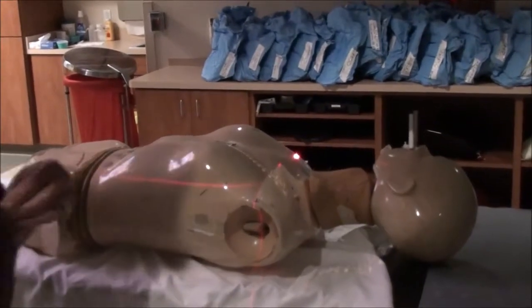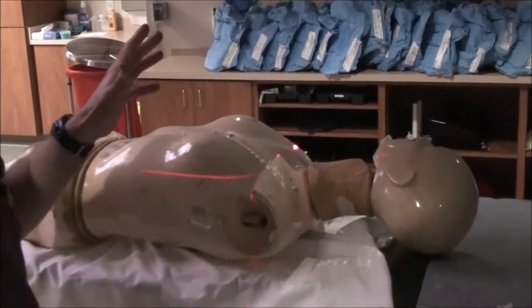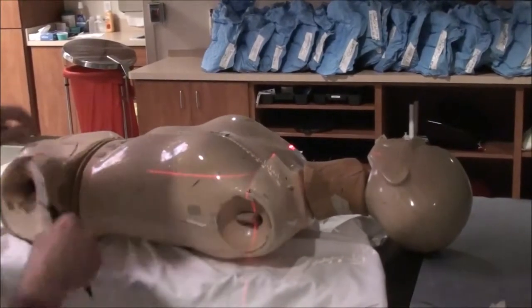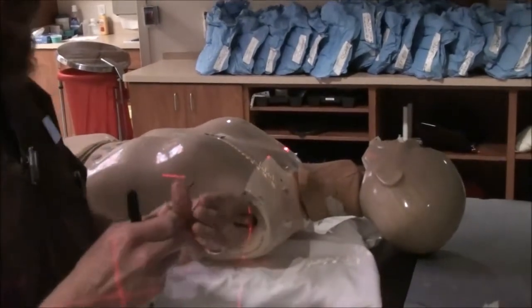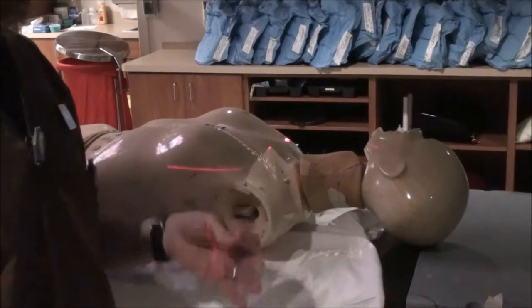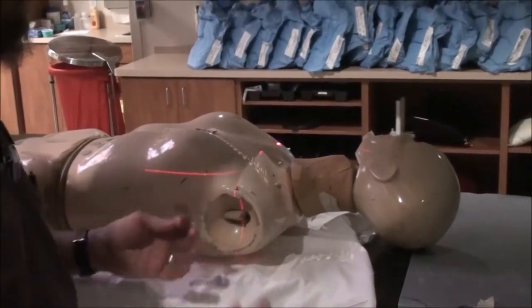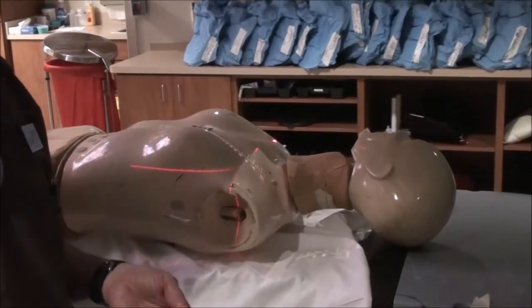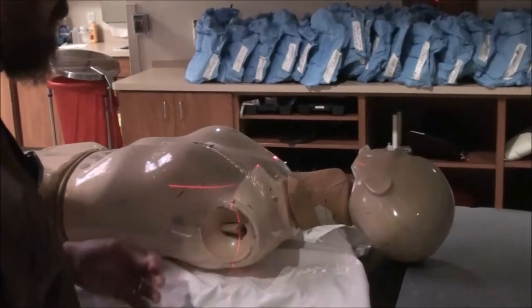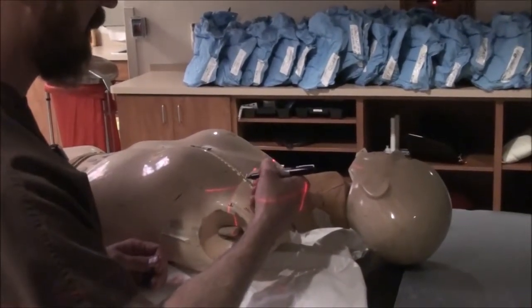I have it set at 100 SSD. When you simulate this, you're going to have a wire that you'll end up placing on this field border. To go over the entire simulation: you're going to ballpark this, go out, fluoroscope, and make sure everyone likes it. Once the doctor likes it, you're going to notate everything before you do anything else. Run back in the room, and the very first thing you're going to do is mark the CR.